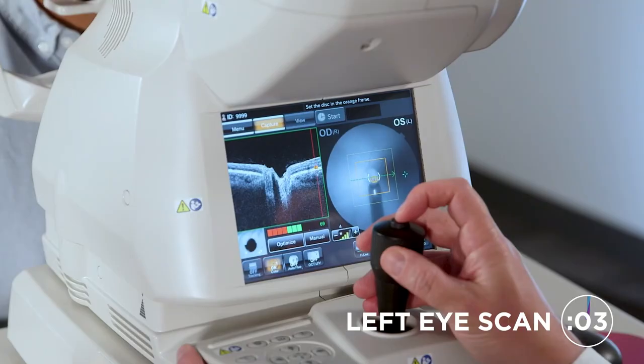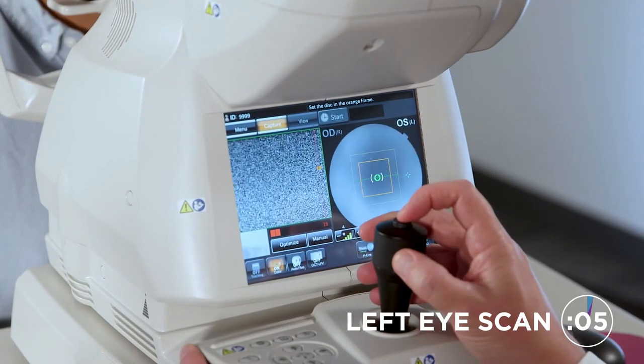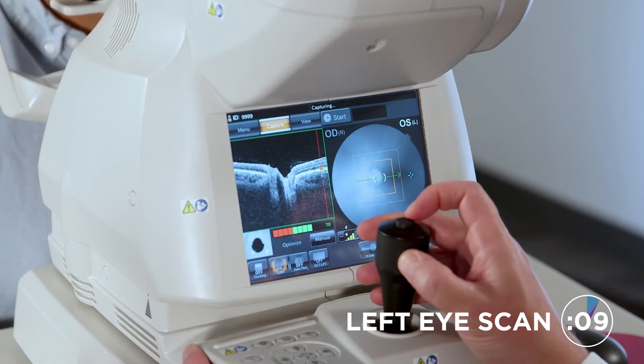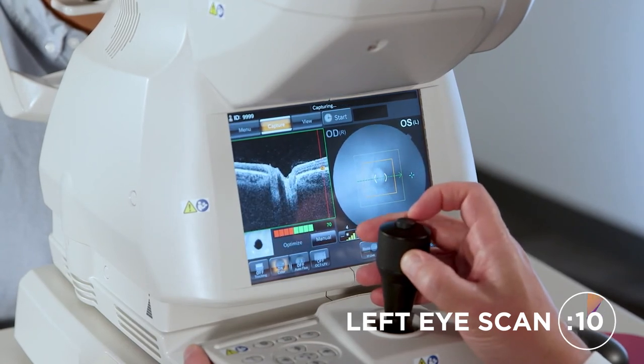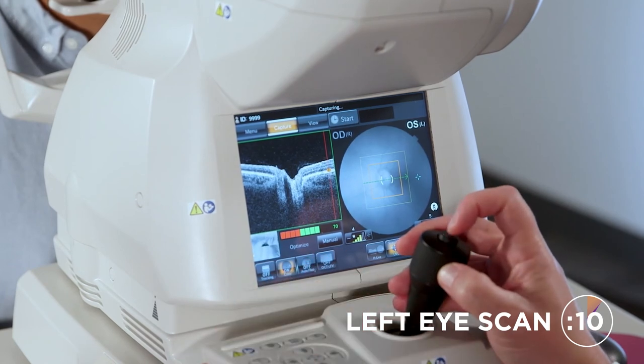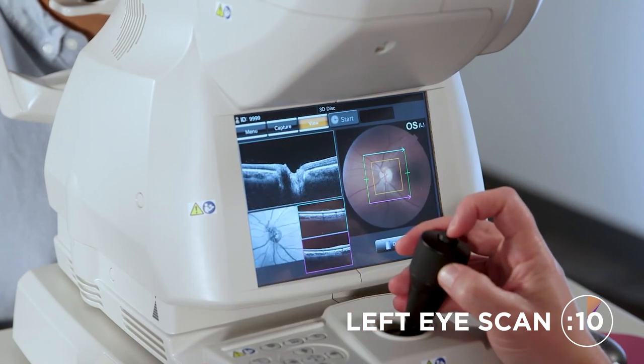Center that X straight ahead. Blink blink. Perfect. Hold it for about three seconds — three, two, one. Hold it. No blinks, good signal strength, good photo. Perfect.